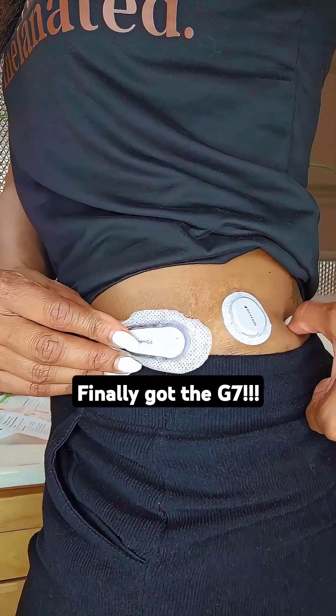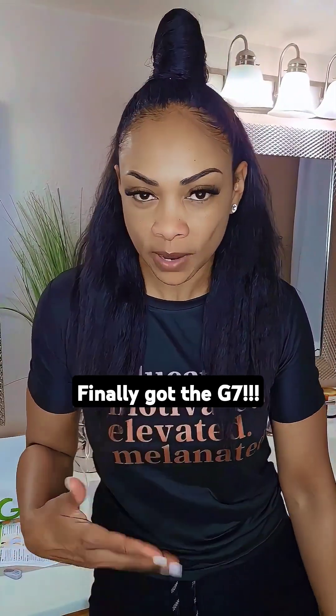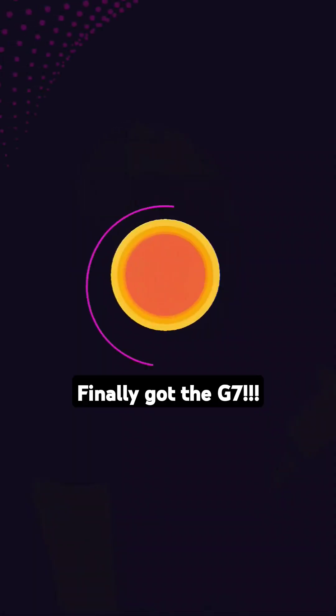With the G6, look at the size difference. And here's the kicker — the old G6 took two hours to warm up and finally read what the blood sugars are. This new G7 will be in business in 30 minutes. Let's go!